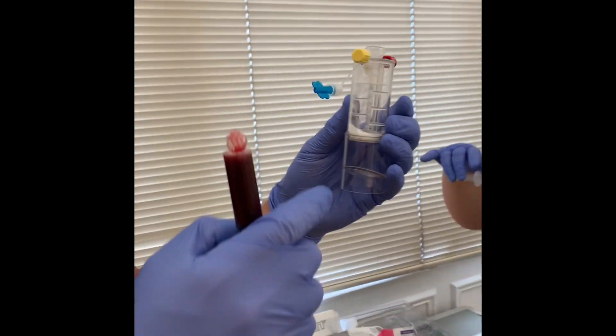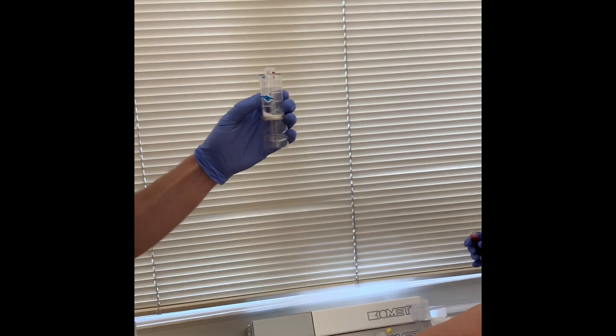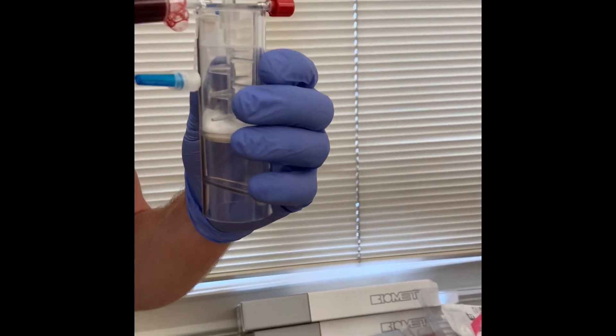So it goes into here. Again, the one with the spare cap on it is the one it goes into. To the green, to the yellow — yeah? So it goes into the yellow one, yeah.